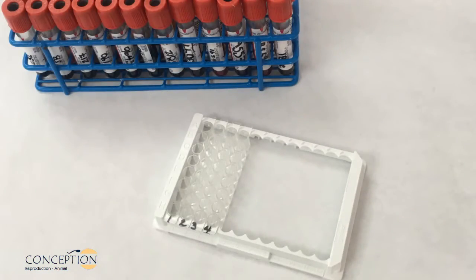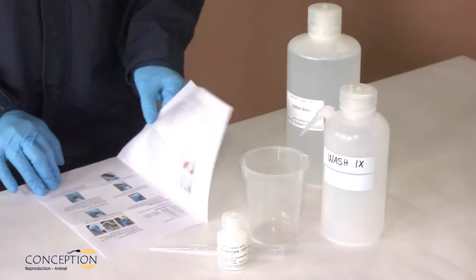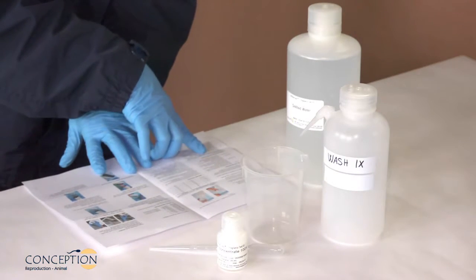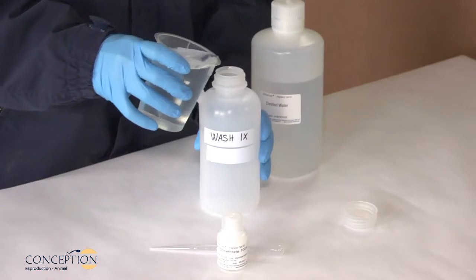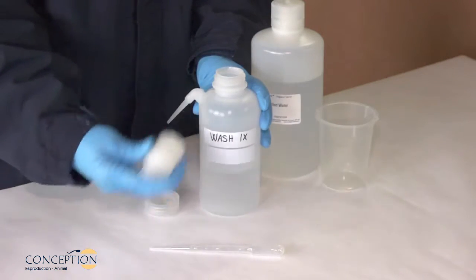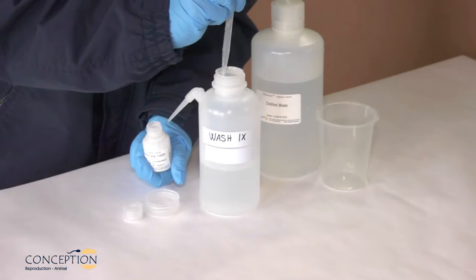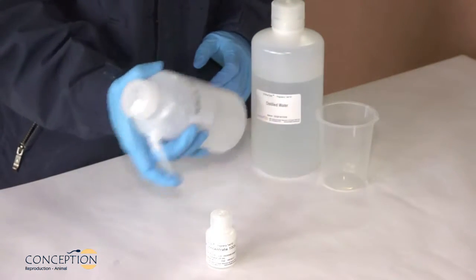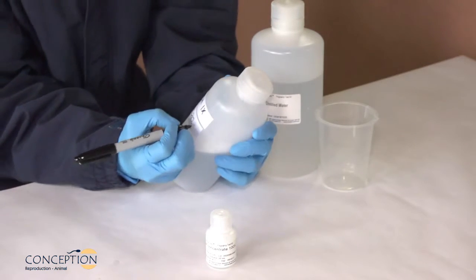We recommend using a maximum of four strips at a time for optimum results — for example, 29 samples plus three quality controls. For preparation of the washing solution 1X, refer to the appropriate section of the protocol and prepare the amount of wash solution required. Measure the volume of distilled, demineralized, or bottled water required and pour into the washing bottle. Shake the 100X wash solution vigorously to mix and ensure homogenization. With a transfer pipette, take the required volume and add to the washing bottle. Shake vigorously. Write the preparation date and the expiry date.